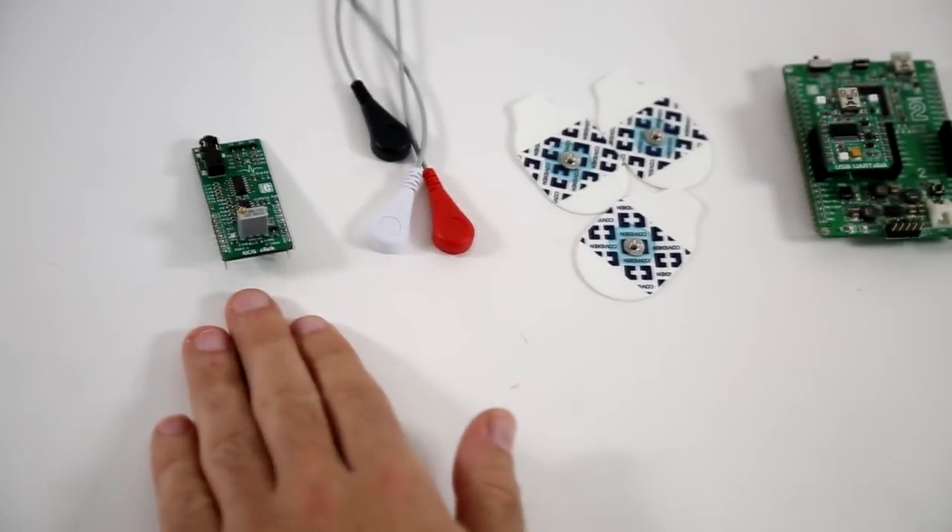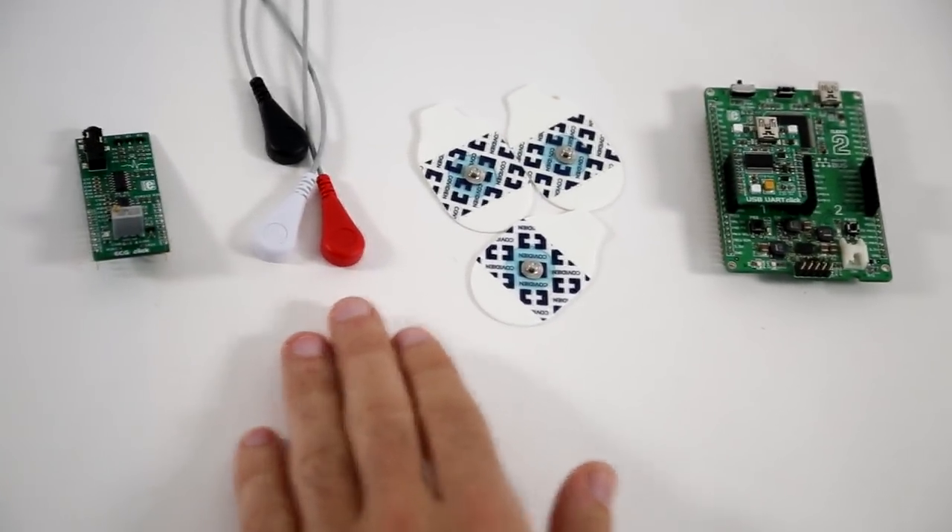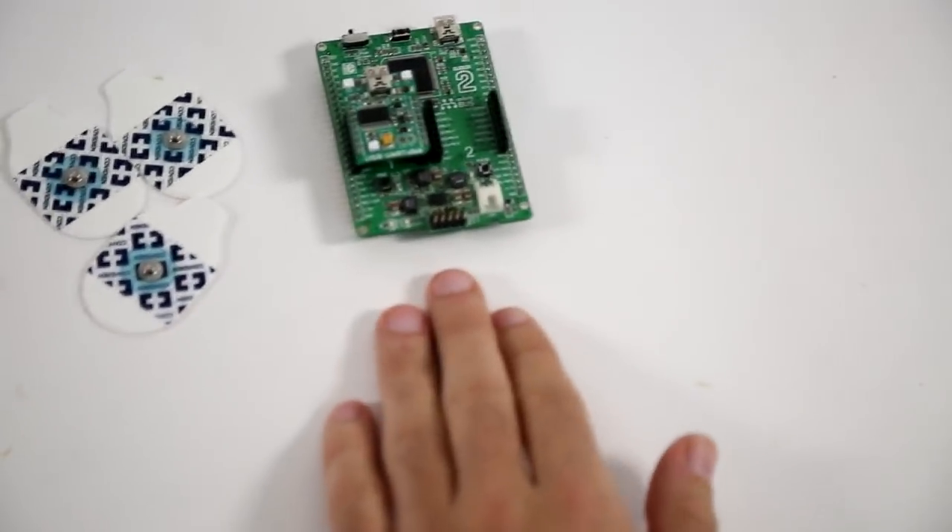You'll need ECG click, ECG cable, ECG electrodes, and of course a development board.